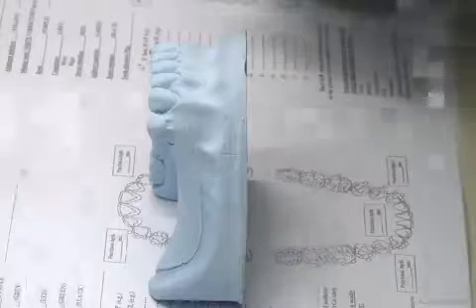Mesially or distally, it depends on the clasp once more. Where am I going to put my clasp? If it's an eye bar, I prefer it to be in the mid-facial, slightly mesial. This is the area of option. What will happen if I have it close to the saddle area? Distal undercut, I begin to think.